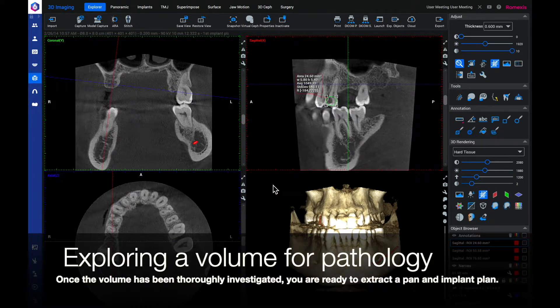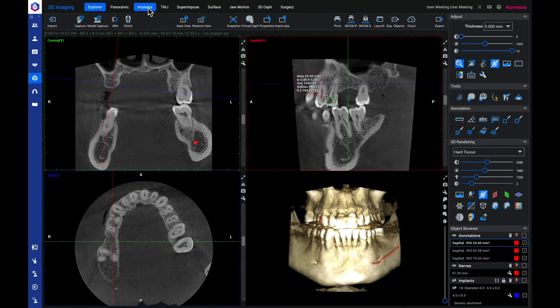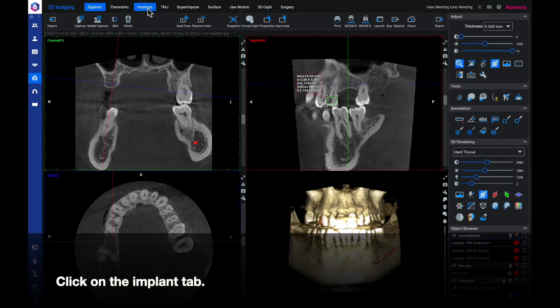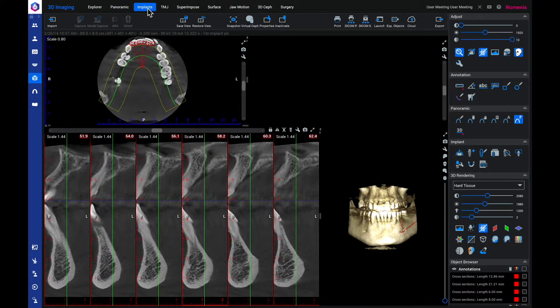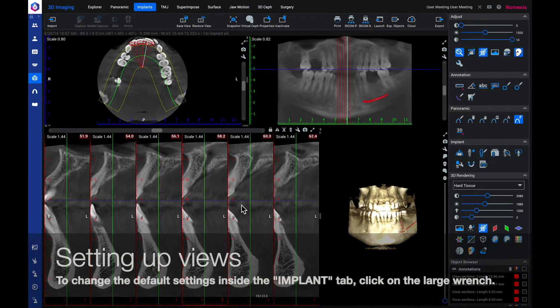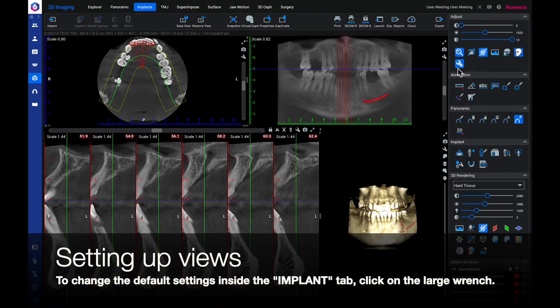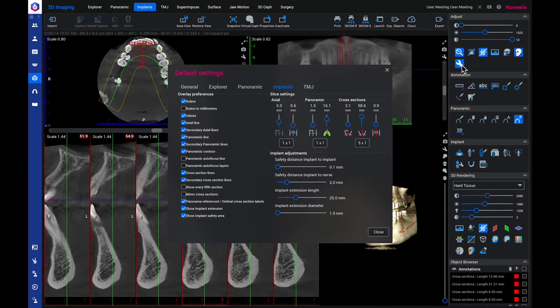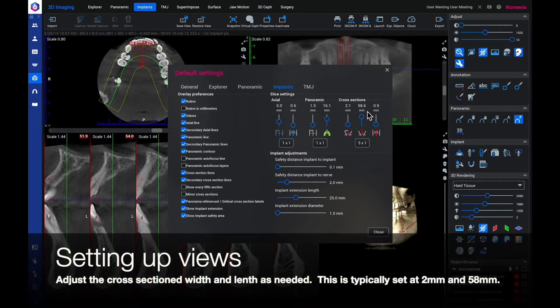Once the volume has been thoroughly investigated, you are ready to extract a pan and begin implant planning. Click on the implant tab. Now we are ready to set up our views. To change the default settings inside of the implant tab, click on the large wrench. Adjust the cross section width and length as needed.